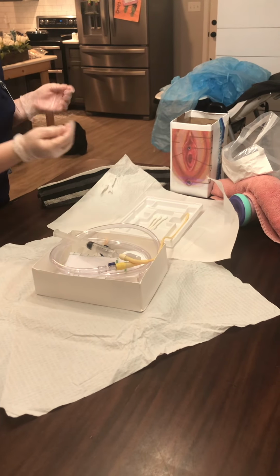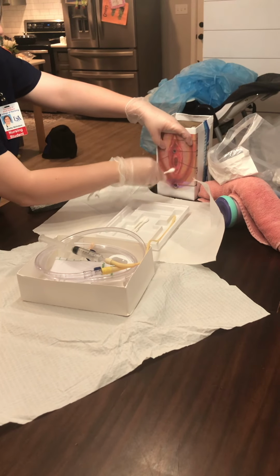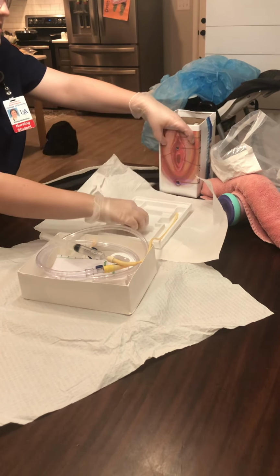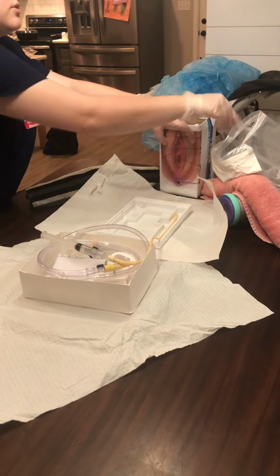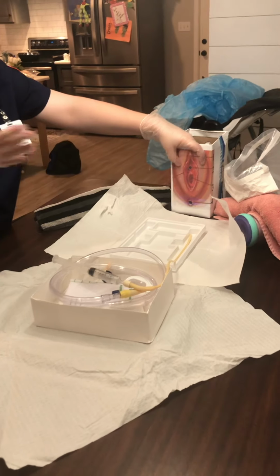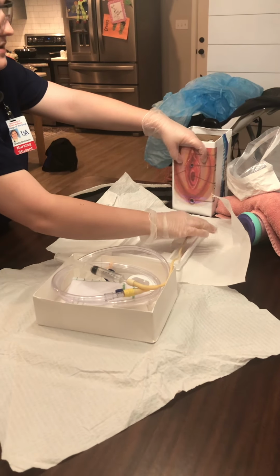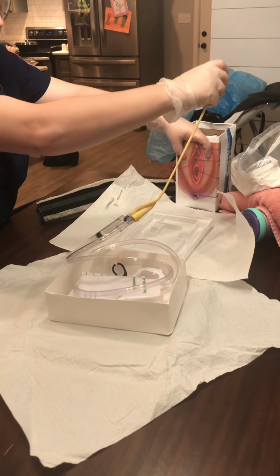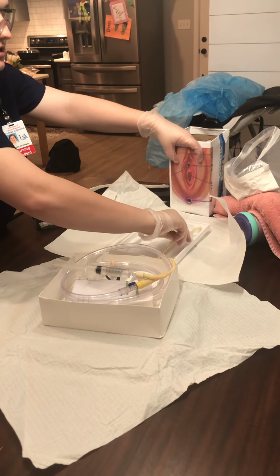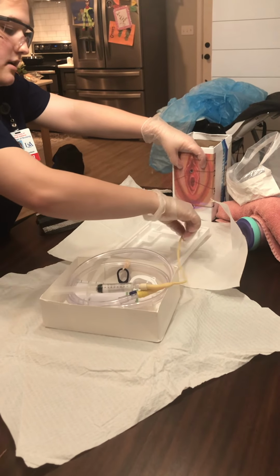So now I'm going to clean. I'm going to grab the labial folds and spread them apart. I'm going to go outer, one swipe down, near, one swipe down, and then top to bottom, middle. Okay, so now I'm going to get the patient to bear down as if they're voiding and take a deep breath, and then I'm going to start. Let me just adjust this real quick. It's coming out.